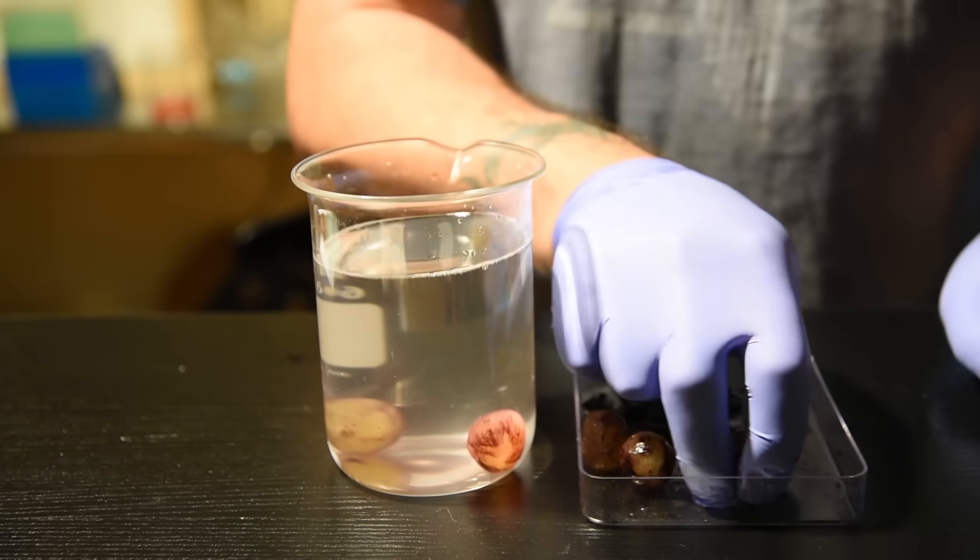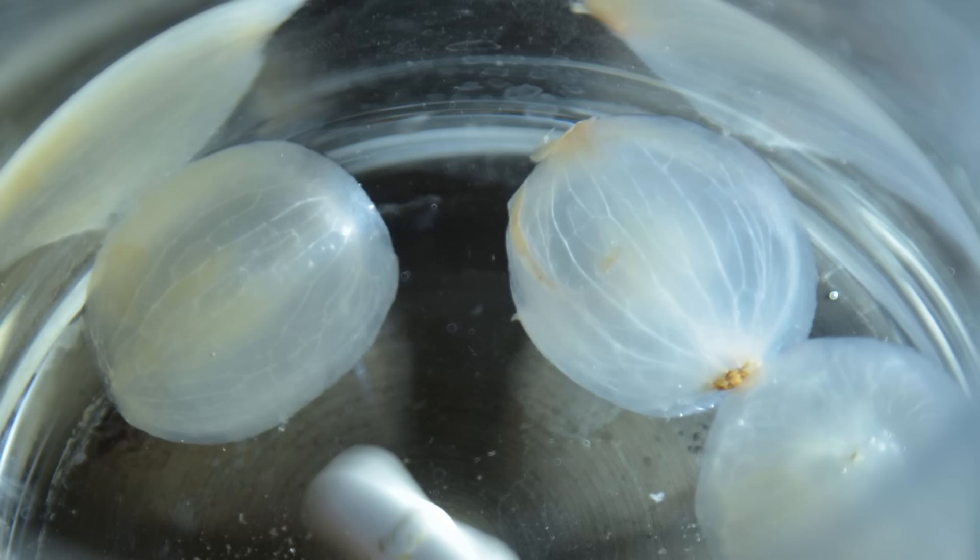But using a special chemical, we can actually remove all of the cells, and this is what it looks like. Freaky, right? This is known as decellularization, and the process gently removes all the cells while leaving that cellulose sponge behind. It's called a scaffold at this point, and has this ghostly white appearance.